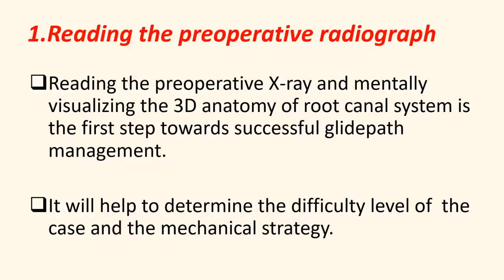Now we will discuss the first step, reading the preoperative radiograph. Reading the preoperative radiograph and mentally visualizing the 3D anatomy of the root canal system is the first step towards successful glide path management. It will help to determine the difficulty level of the case and the mechanical strategy. I suggest you read at least these following points in the radiograph before starting any root canal treatment.